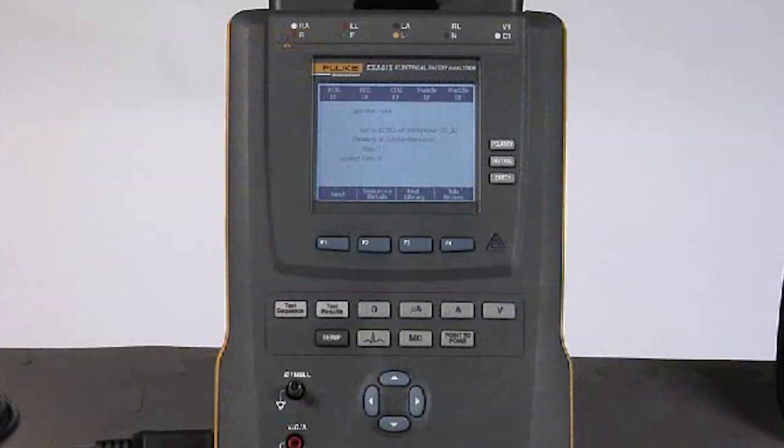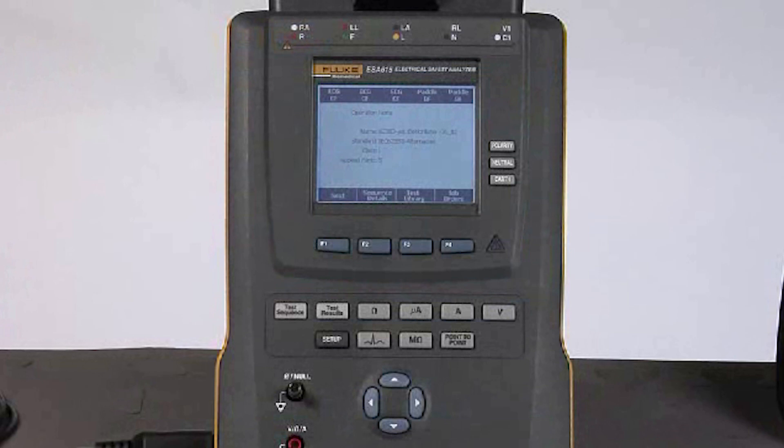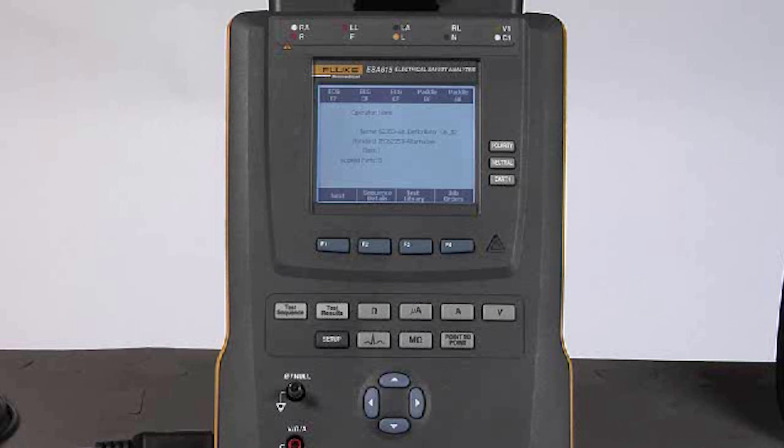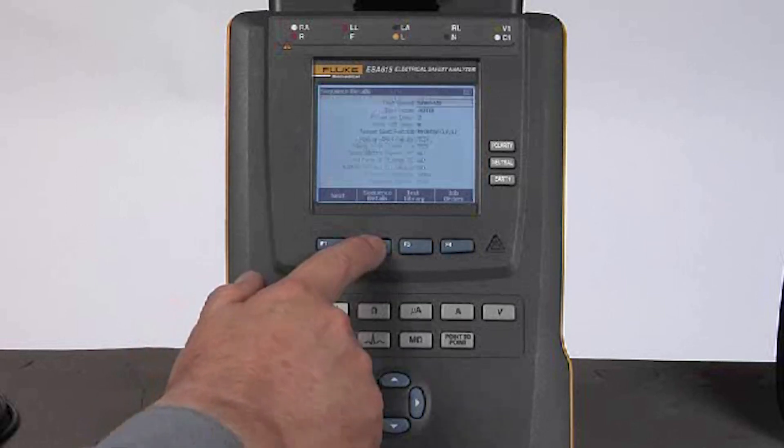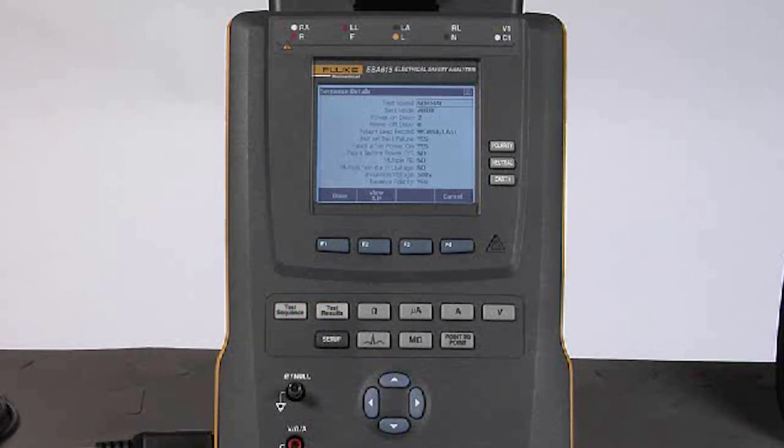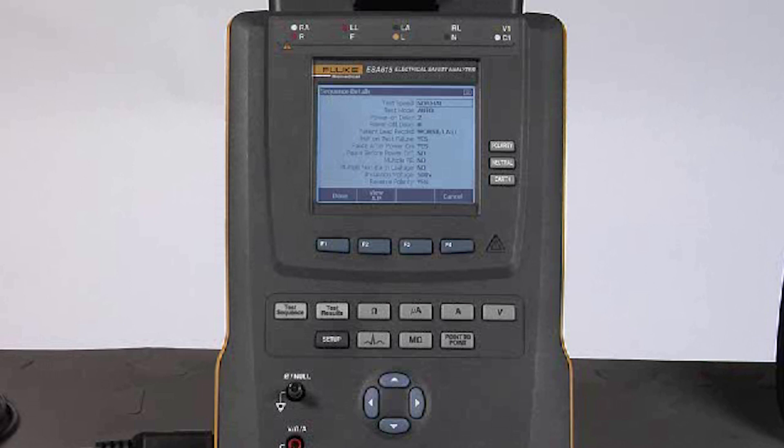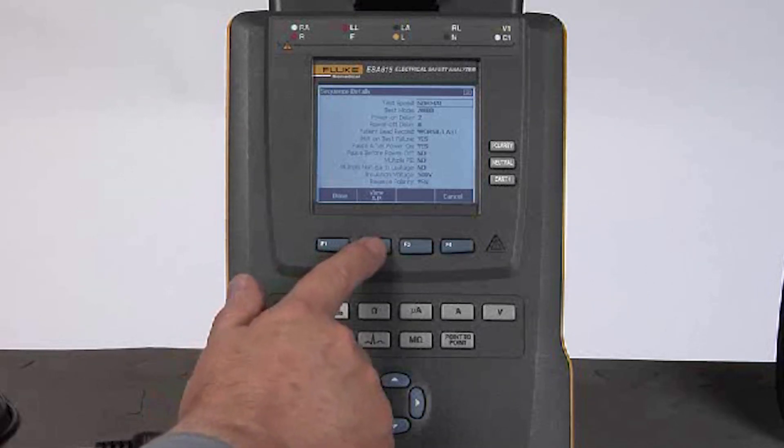If I want to see the details about this test sequence before I run it, just to be sure that all of the control parameters are as I expect them to be, I will press the F2 button. Now I can use the navigation arrows to scroll down through each of the test steps in the test sequence to make sure that they are set properly for what I need to do.